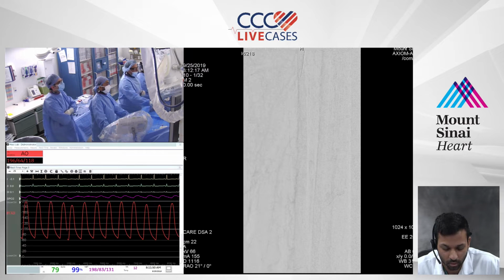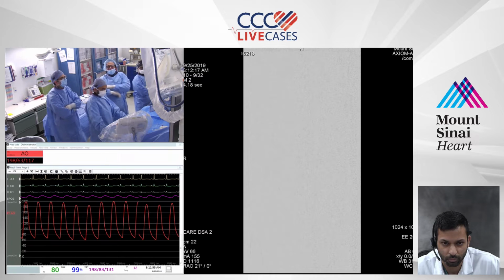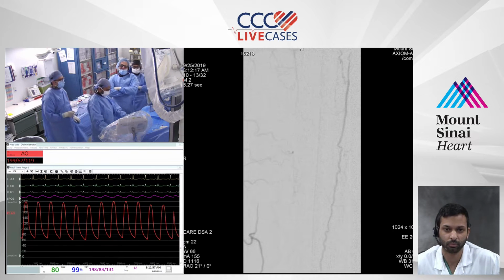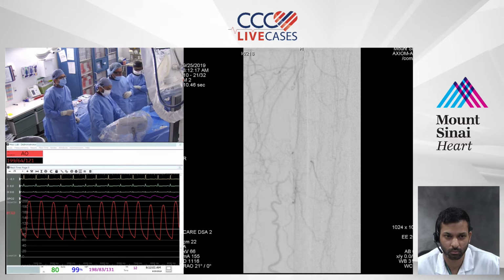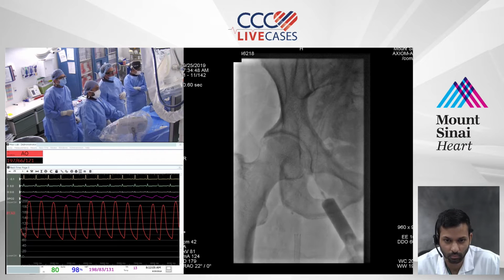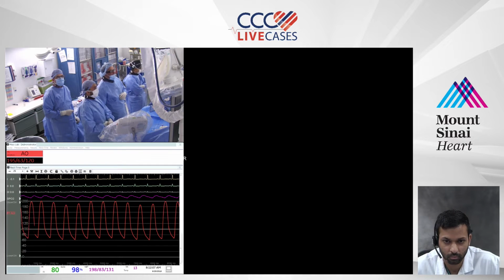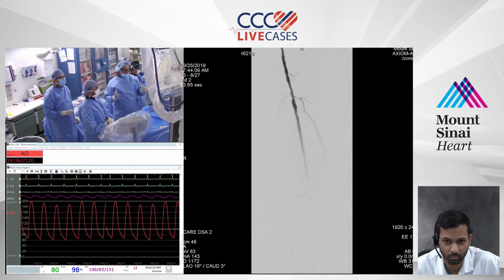So I think here we are. So our strategy, and I think that's a great discussion, our strategy really has been exactly what you said. So I think for me, and it's great to have you here because we can talk together, when I look at this angiogram, and I always tell our colleagues, you need to understand what are the things that can not only go right, but what can possibly go wrong, right?